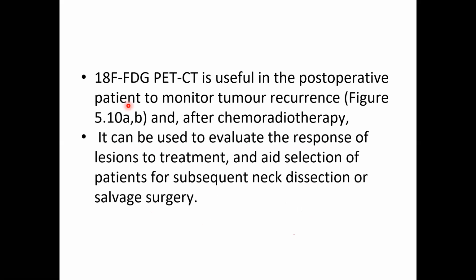18F FDG PET CT is useful in post-op patients to monitor tumor recurrence and after chemoradiotherapy. It can also be used to evaluate the response of lesion to treatment and aid selection of patients for subsequent neck dissection or salvage surgery. So you should know it in the post-operative patient also. You can do it for tumor recurrence and after chemoradiotherapy, to see the response of the lesions to the treatment, and for selection of the patients for subsequent neck dissection or salvage surgery. So PET scan is very important.